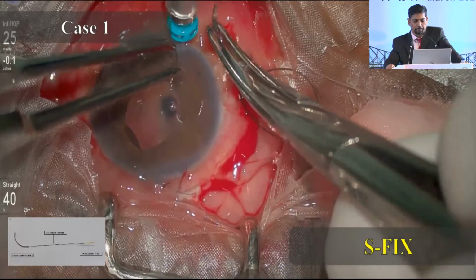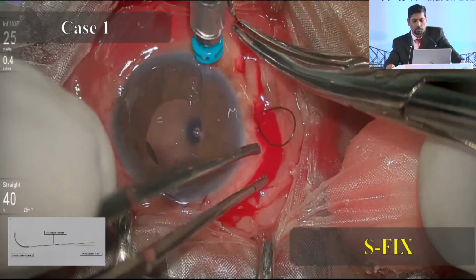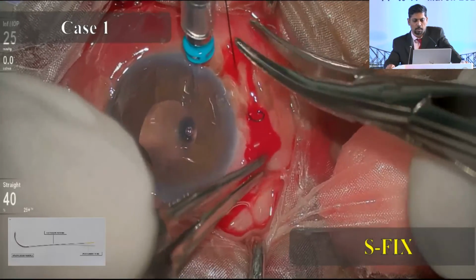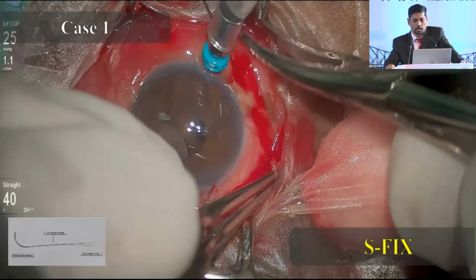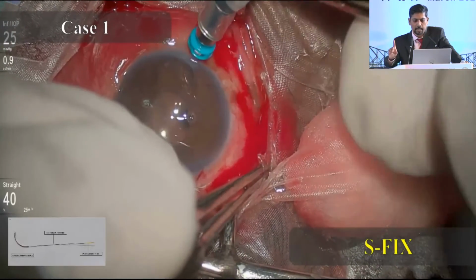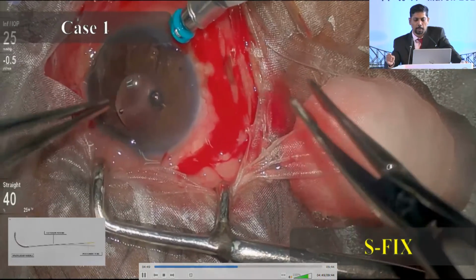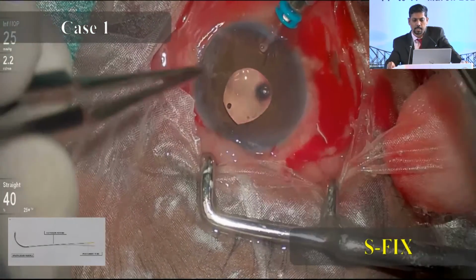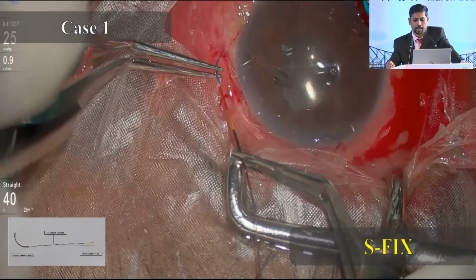Keep pulling. Retrieve the needle. The needle is out. Suture is out. Keep retracting the nylon suture. The polyamide tube comes out. Again, you will see that the haptic doesn't come out, it stays over there. It gets fixed inside the 380 micron, that's the suture needle size, the sleek suture needle track that you have created. The haptic is inside there.